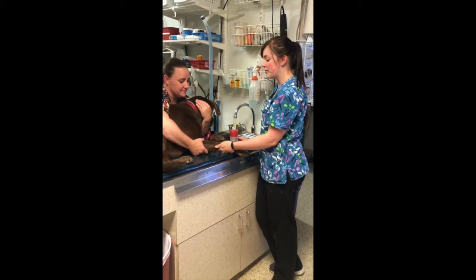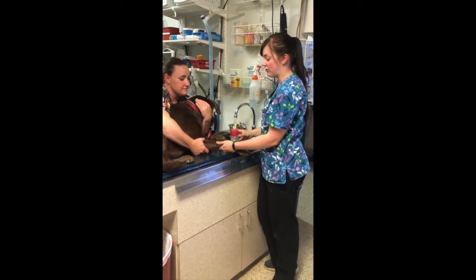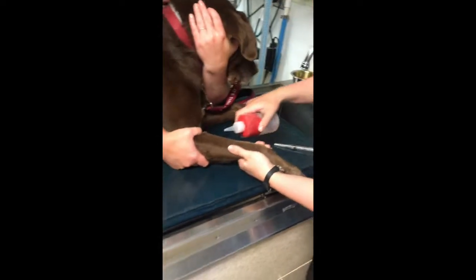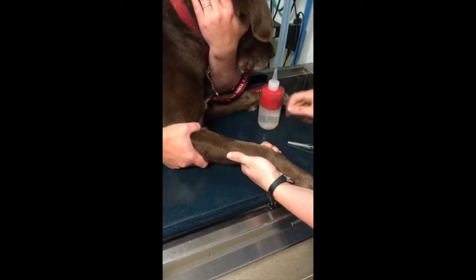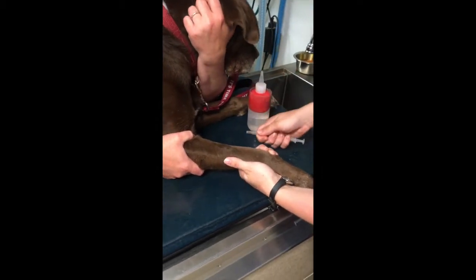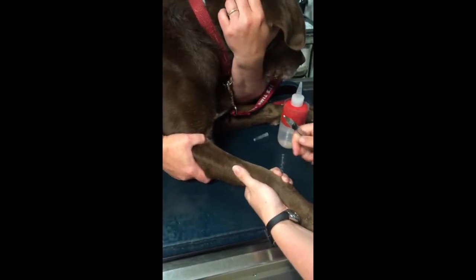Alright, this is Ruger, and I'm going to be demonstrating how to give an IV injection. So I have my assistant holding off his vein here. I'm going to have some isopropyl alcohol, so I'm going to go ahead and put that on there. So I have half a ml of saline that I'm going to give to him IV. Go ahead and take the cap off.